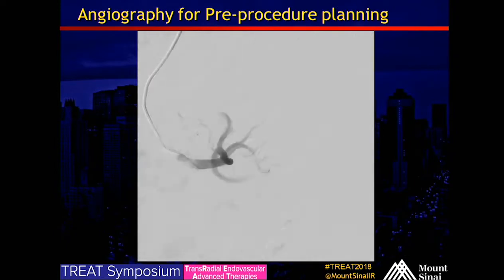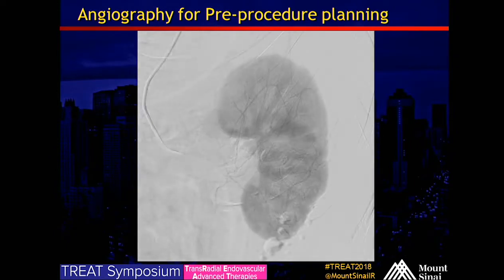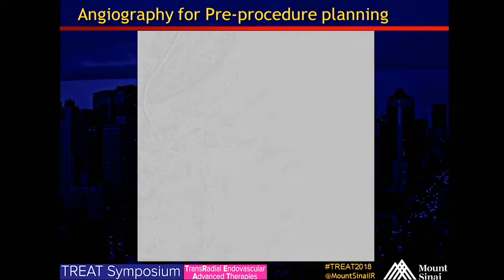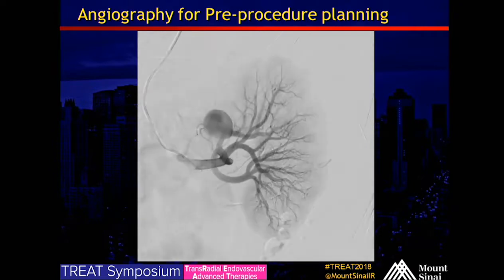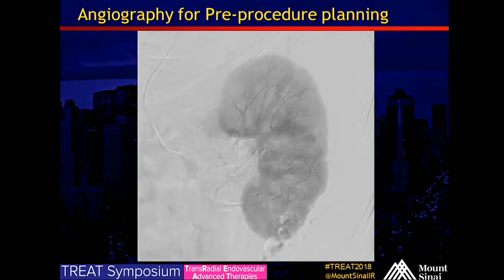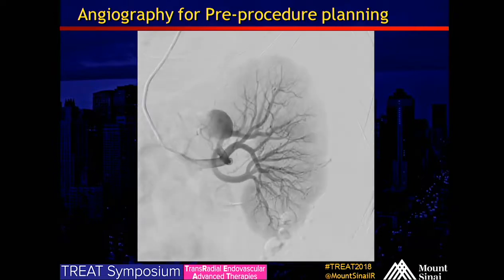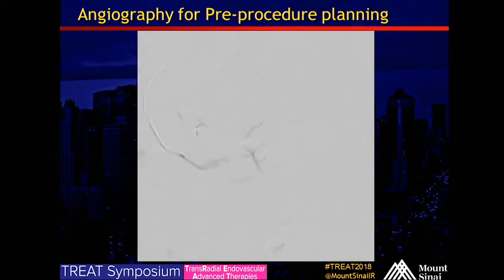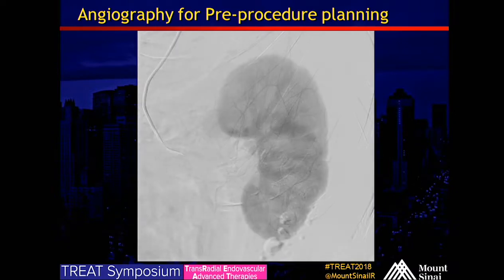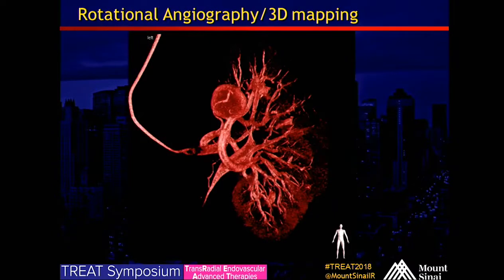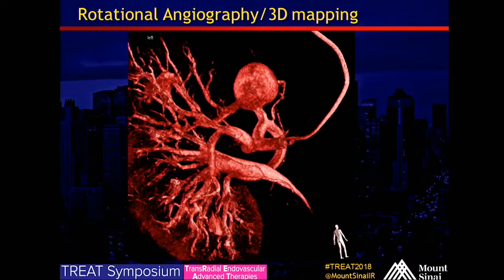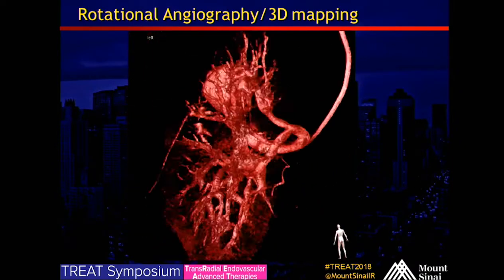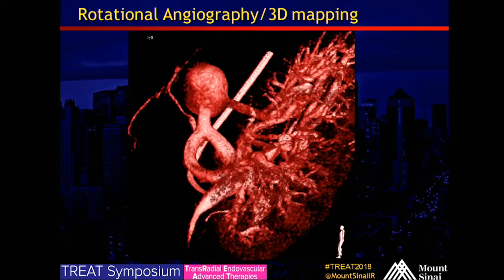A couple weeks ago we brought him for an angiogram for procedure planning. This is our diagnostic angiogram from the left renal artery via radial access, and you can see there's robust filling of that aneurysm off the upper pole branch right there. We did rotational angiography for 3D mapping to prepare for today's procedure.